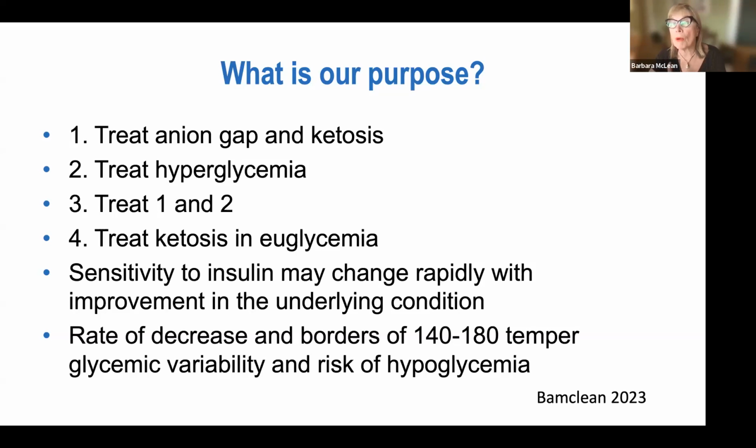But as time goes on, Glucommander is evaluating algorithmically the patient's response to the increase in insulin, and the multiplier will adjust accordingly. You should never, ever go in and change the multiplier on Glucommander. That is done automatically. We had 2 CTS patients where that occurred, and unfortunately, those patients became hypoglycemic.